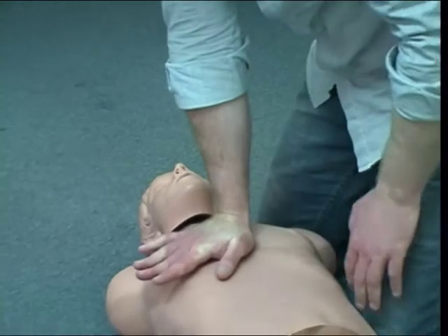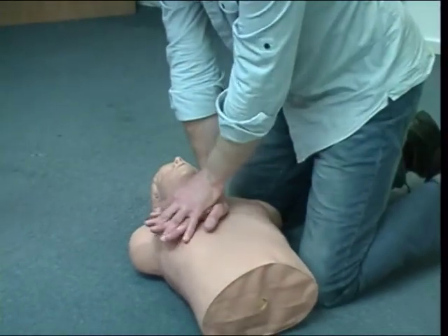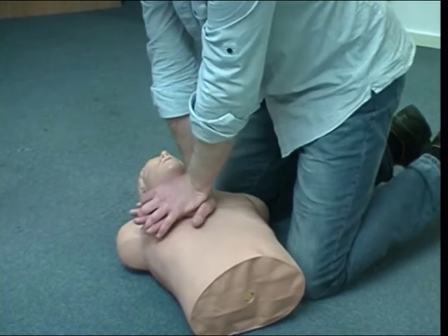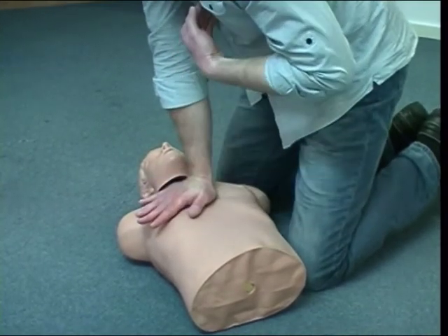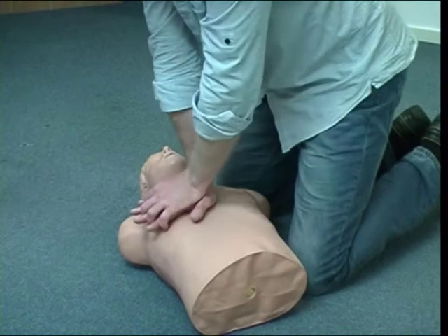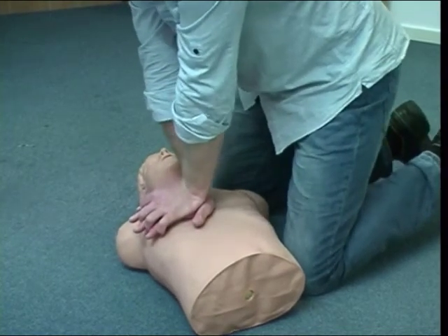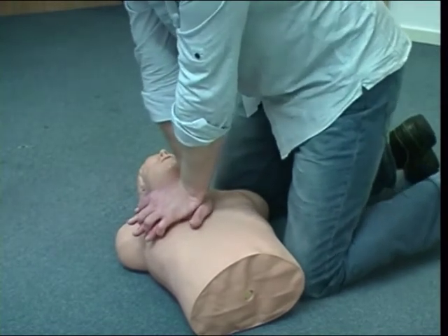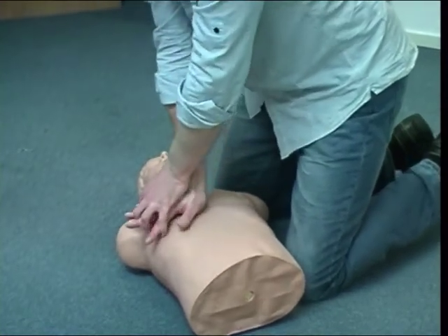Ideally, you're going to have your knees as close to this person as possible because you really want to use your body weight to drive these compressions. I always aim to have the centre of my chest over the centre of this person's chest, and that kind of stops me rocking when I'm doing CPR as well. So you'll notice that all the movement comes from my hips when I'm doing this.